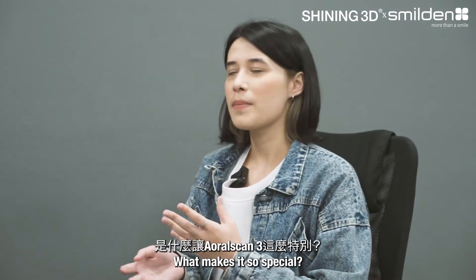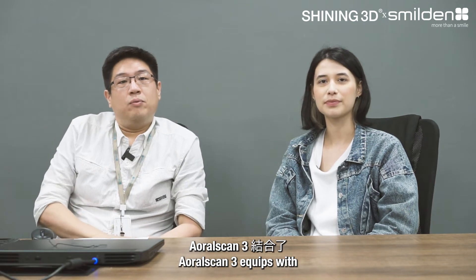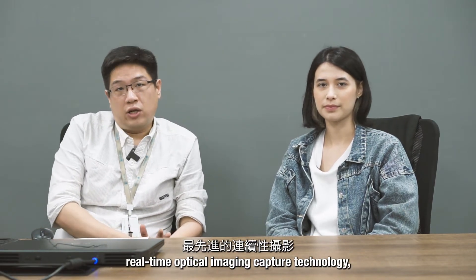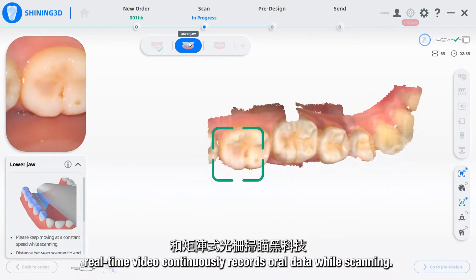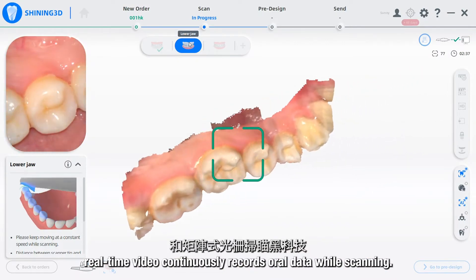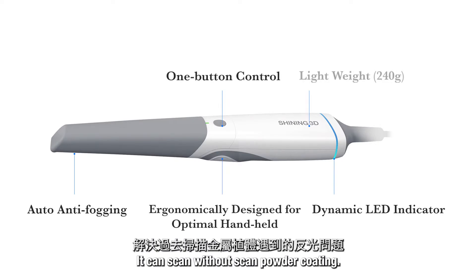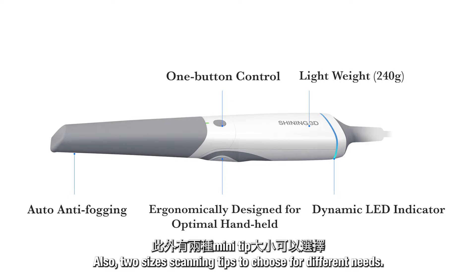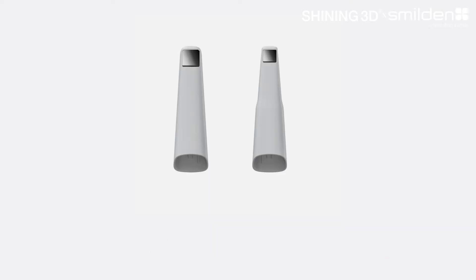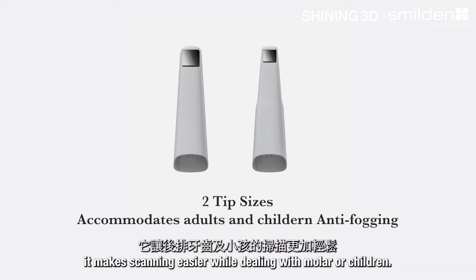So what makes it so special? The AoralScan3 is equipped with real-time optical imaging capture technology. Real-time video continuously records oral data while scanning. It also comes with a cool feature for metal scanning — it can scan without powder coating, which is much more accurate. Additionally, two scanning tip sizes are available for different needs. The mini tip, the smallest tip on the market, makes scanning easier when dealing with molars or children.